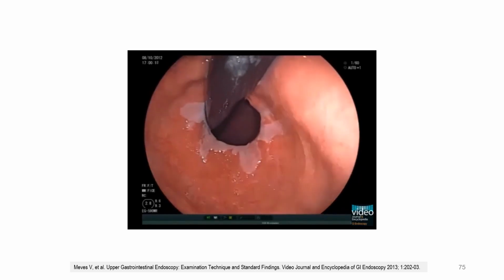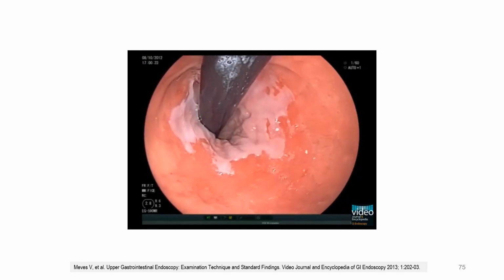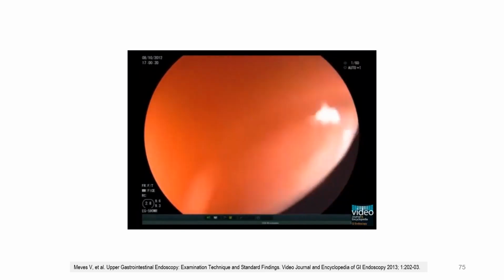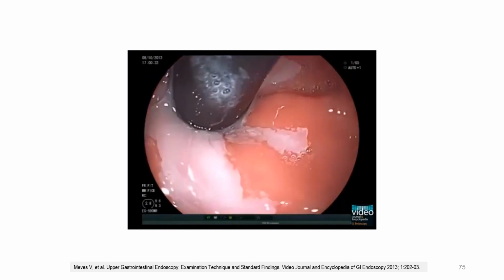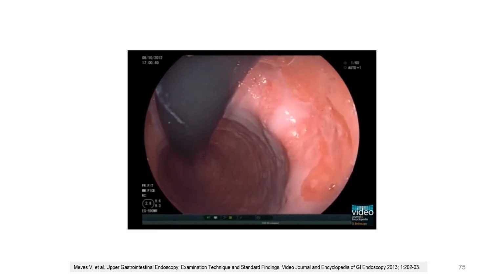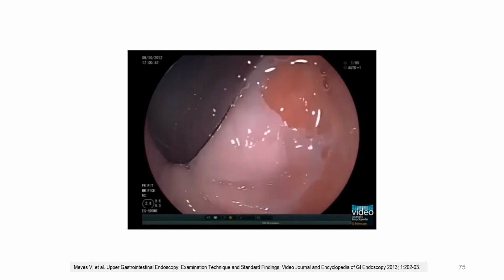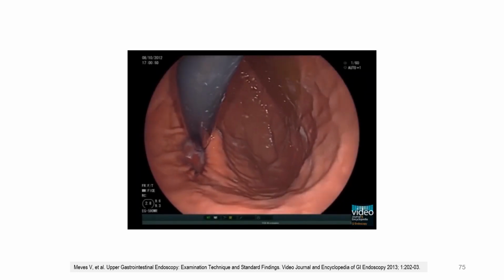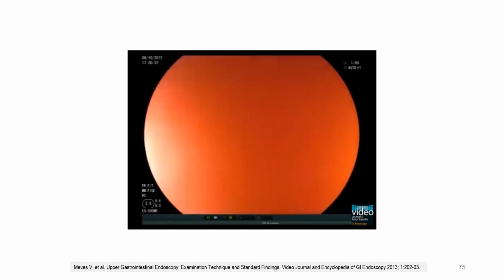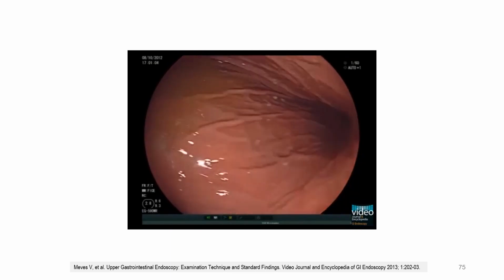We pull the tip of the endoscope inside this hernia and perform a 360-degree rotation, both clockwise and counterclockwise, to complete the retroflexed view. This maneuver allows close inspection of the short Barrett segment. After examination of the cardia and fundus in retroflexion, return the endoscope tip to the original position in the upper body. Withdraw the endoscope with arc-like movements to examine the upper body and cardia.